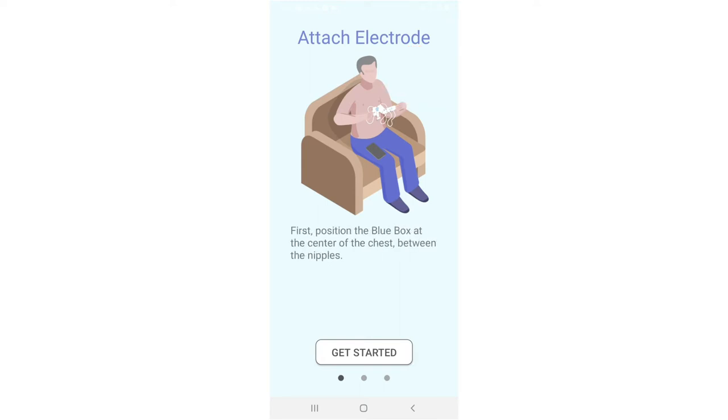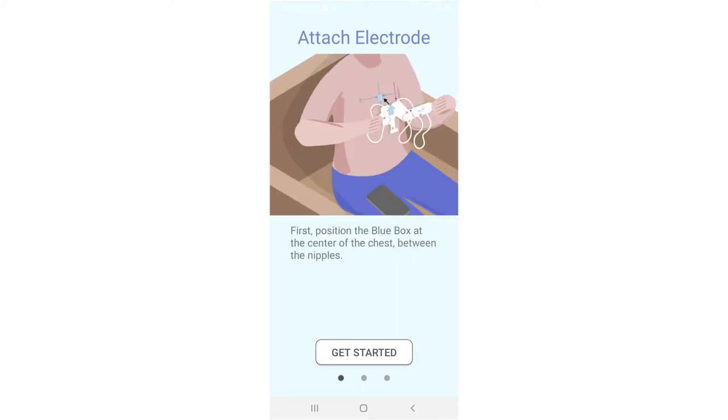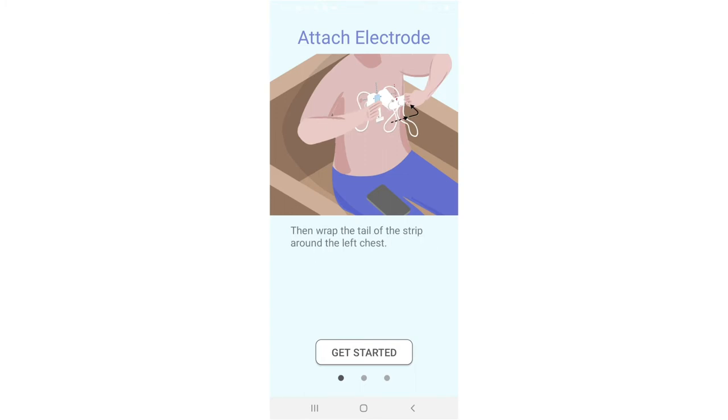First, position the blue box at the center of the chest between the nipples. Then wrap the tail of the strip around the left chest.